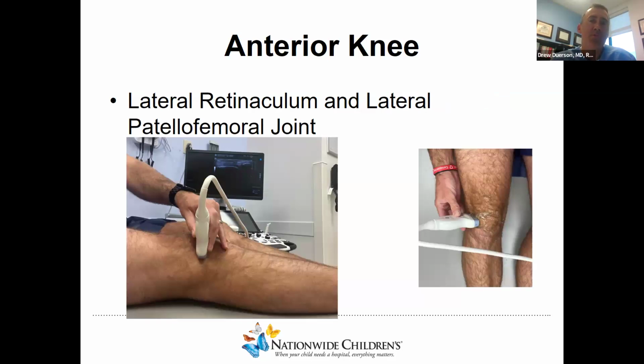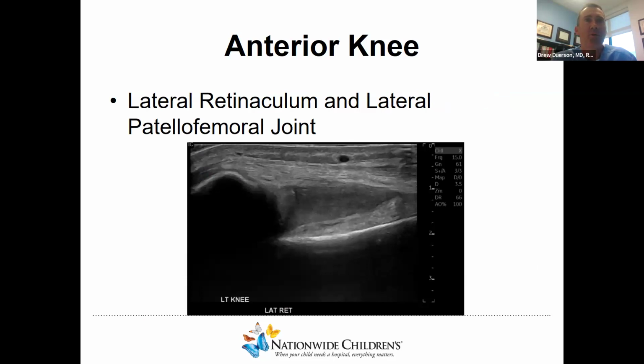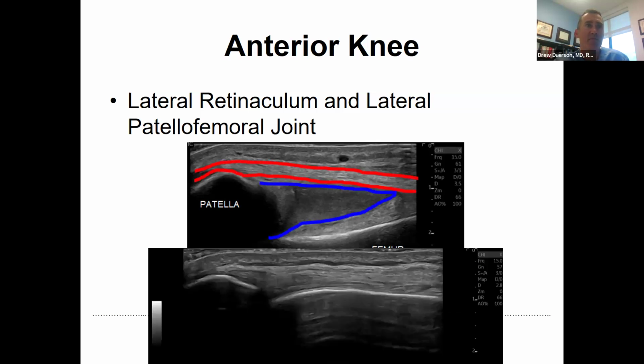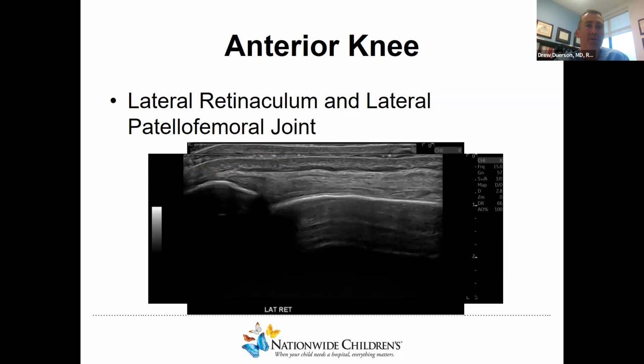And now we move back up proximally just a bit, and we'll focus our attention on the very important patellofemoral joint. So here's the position for the lateral retinaculum and the patellofemoral joint. In our patient, we can see some fluid distending that lateral joint recess, no loose bodies. The overlying lateral retinaculum is intact, which is often the case, as seen in red here, unless the patient has a history of a lateral release, which is a common procedure in patients with chronic recurrent patellar instability. So you want to take a look, especially in this case. And then again, have the contralateral side to compare, and we can see what normal looks like.